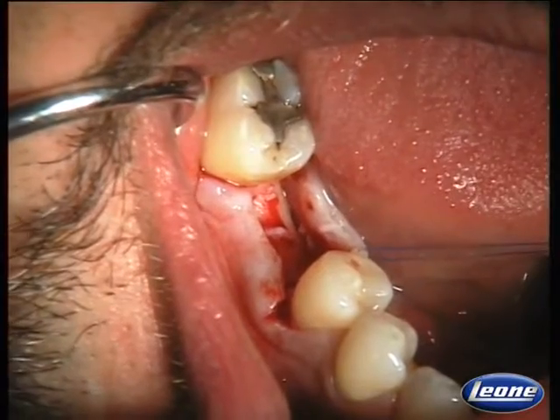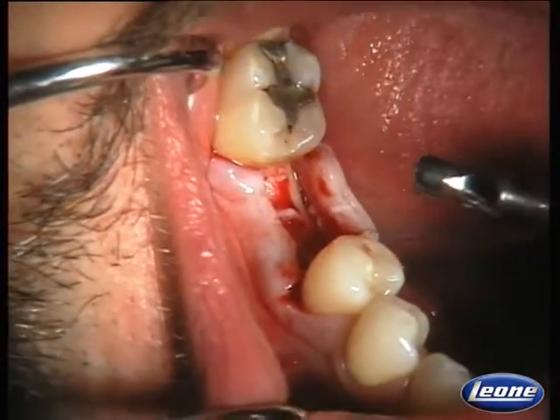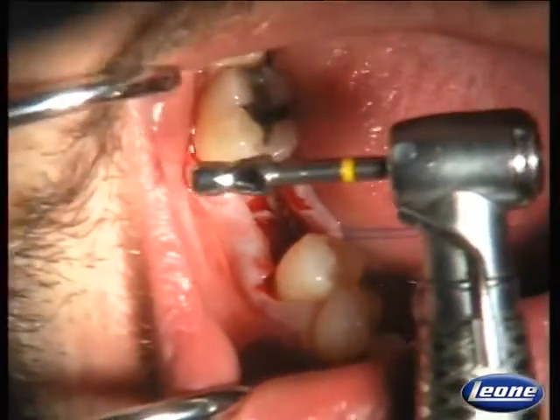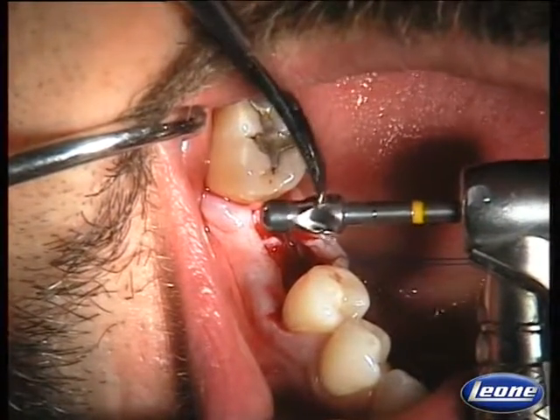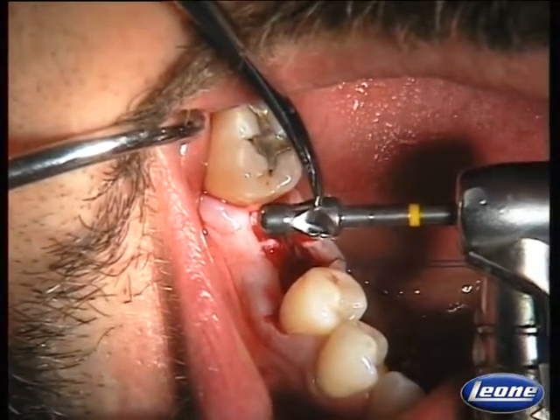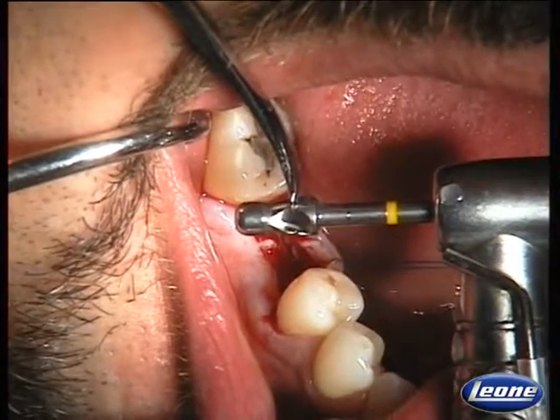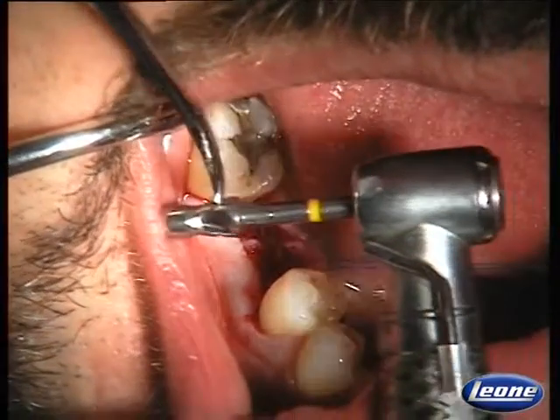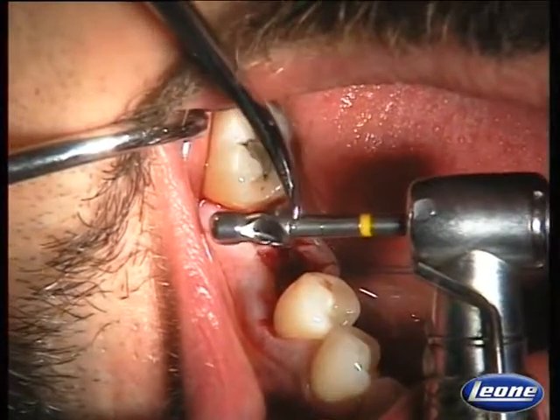To do so, we have to use a countersink. The countersink has a cylindrical non-cutting portion and a larger cutting portion on which we can find a reference mark. If we use the countersink down to the reference mark, we can prepare the coronal portion of the implant site for an implant positioning at bone level. If we want to place the implant a little deeper, we have to go as well deeper within the countersink in accordance with the planned implant position.